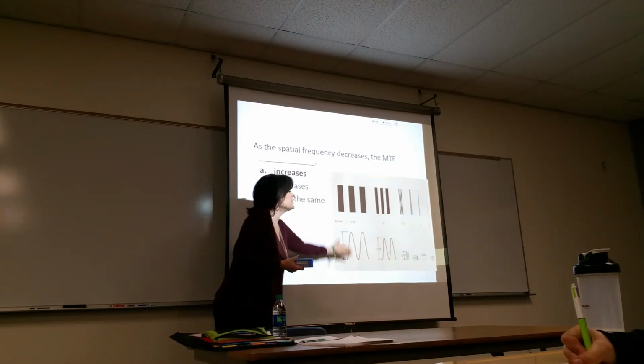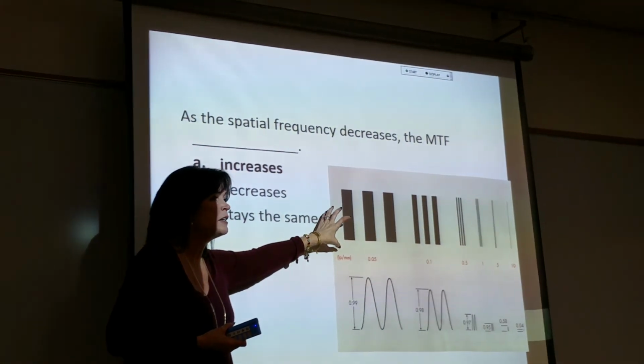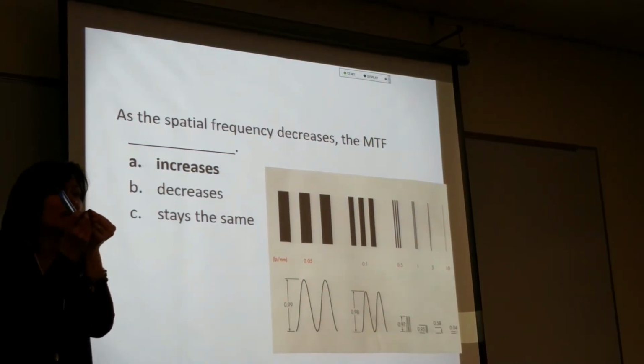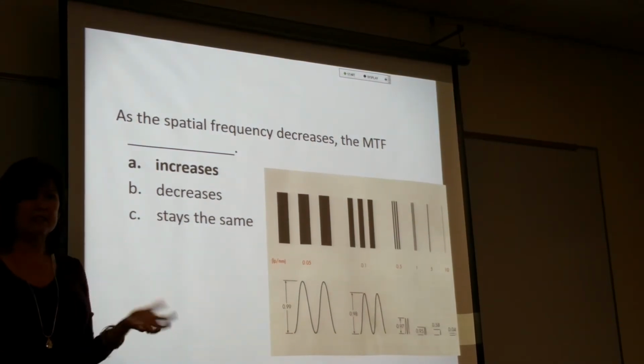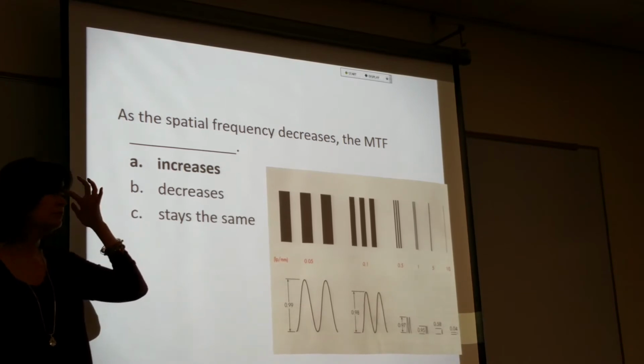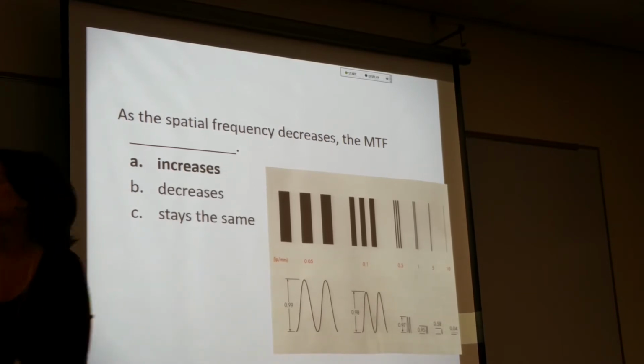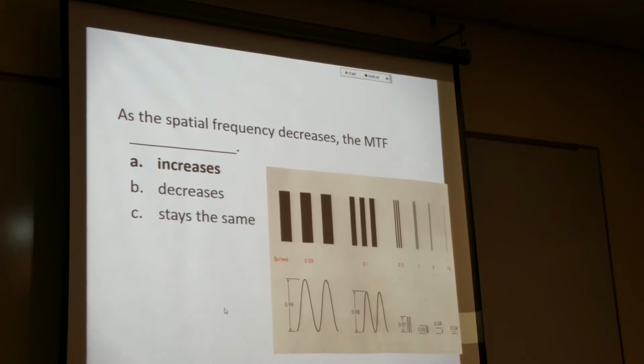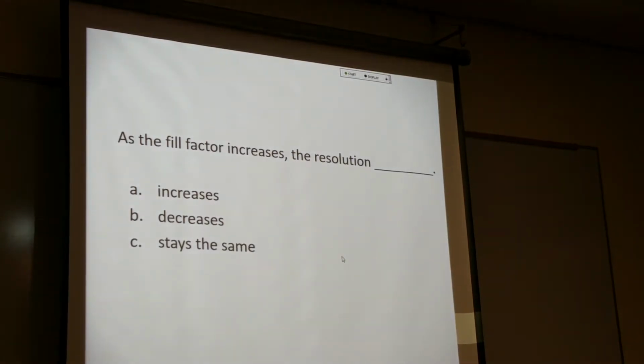In other words, you know what this says right here, it's easier to image larger objects than teeny tiny minute objects. And that makes sense, doesn't it? So it is an inverse relationship. Okay, start here.